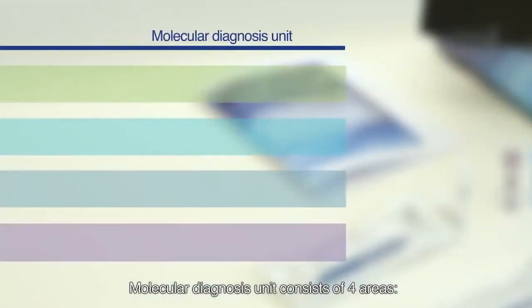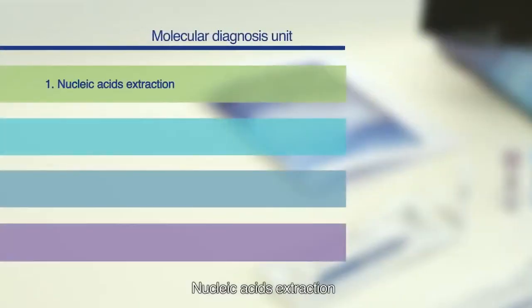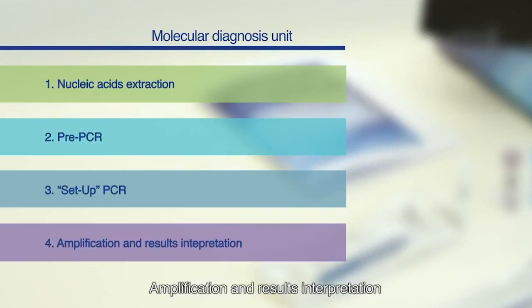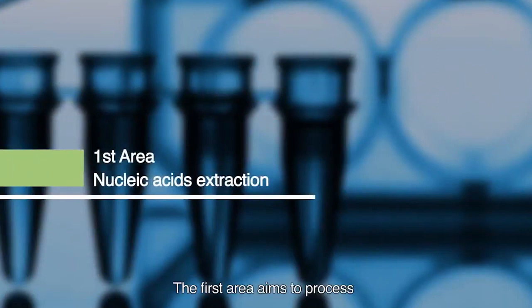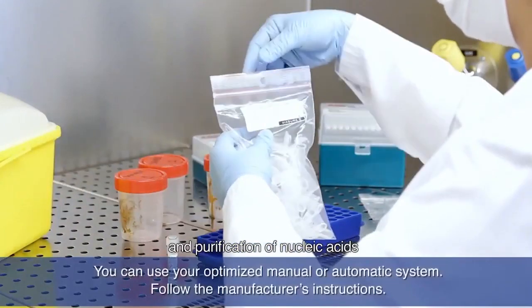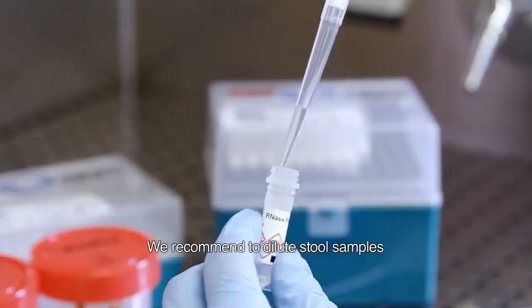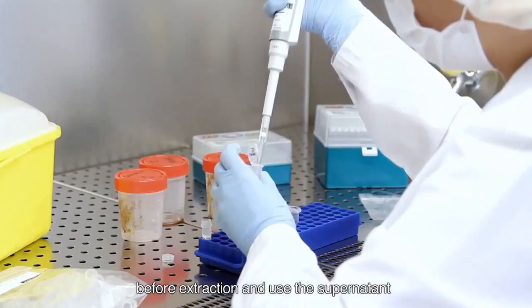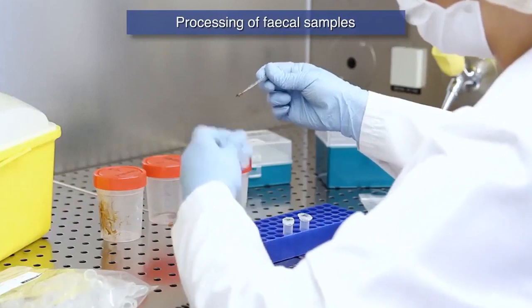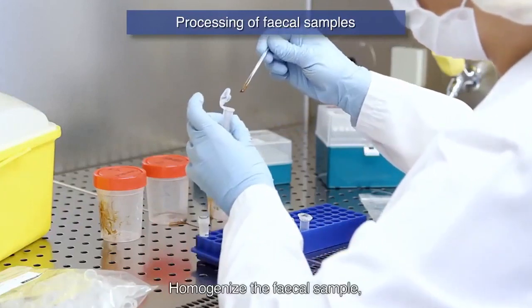The molecular diagnosis unit consists of four areas: nucleic acids extraction, pre-PCR setup, PCR amplification, and results interpretation. The first area aims to process potentially infectious samples and perform subsequent extraction and purification of nucleic acids. We recommend diluting stool samples before extraction and using the supernatant to perform DNA-RNA extraction.